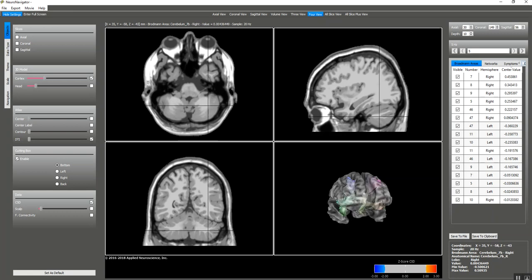That would be useful to be able to evaluate balance problems and various issues dealing with the cerebellum, and also to have a more complete view of the problems that patients may bring to you.